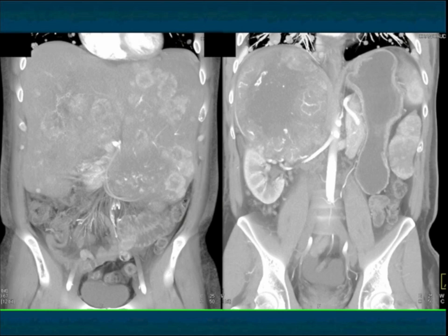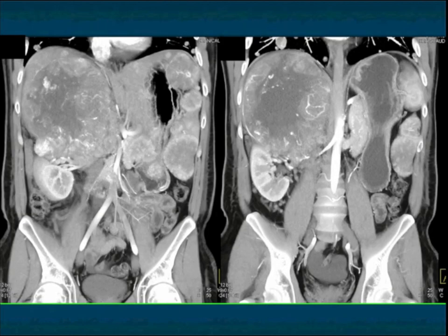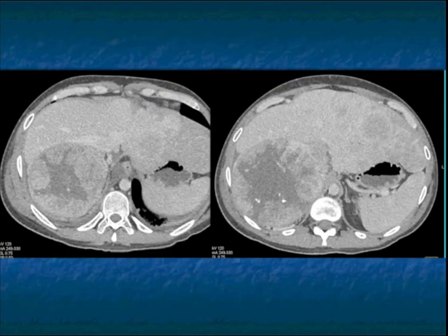Now, obviously, a case like this with so many liver lesions is probably not going to matter, but some cases have solitary lesions, and then it could indeed be very critical. Again, showing you the tumor necrosis, and you can see from these first 3 or 4 cases how things look very similar. We're on the right side.